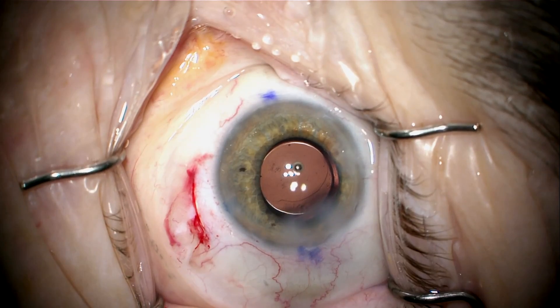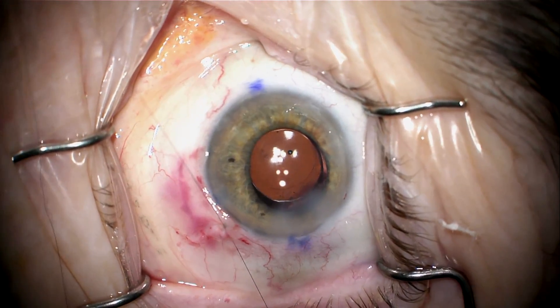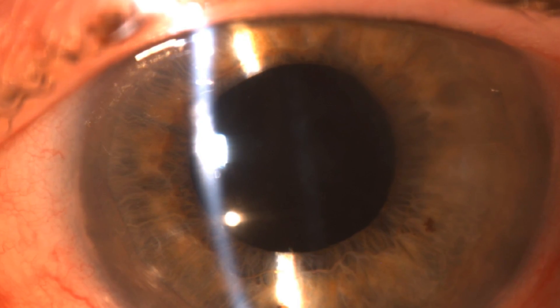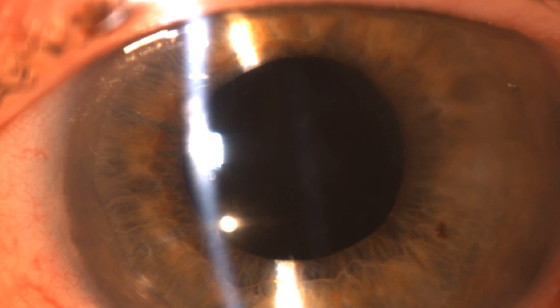It will never create problems for this patient. We close the conjunctiva and the case is completed. The lens is well-centered. The next day in the office, the patient's vision is 20/25 uncorrected, and she's seen clearly for the first time in many years.